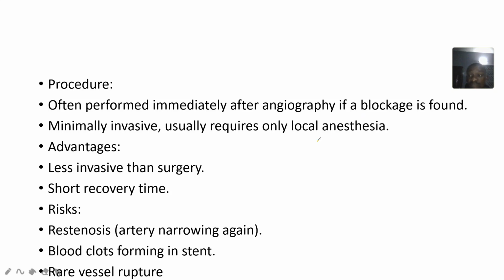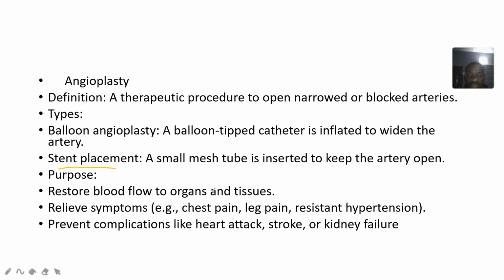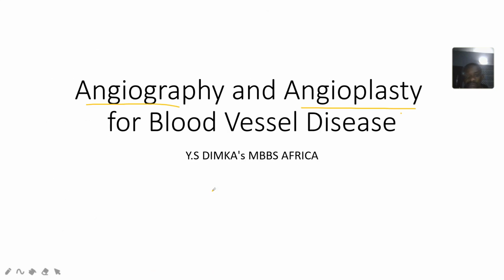The advantages are that it is less invasive and there is a short recovery time. Sometimes the narrowing could come back again, and they call that restenosis, so you have to always do it very well. So that's it for what we have for angiography and also angioplasty.